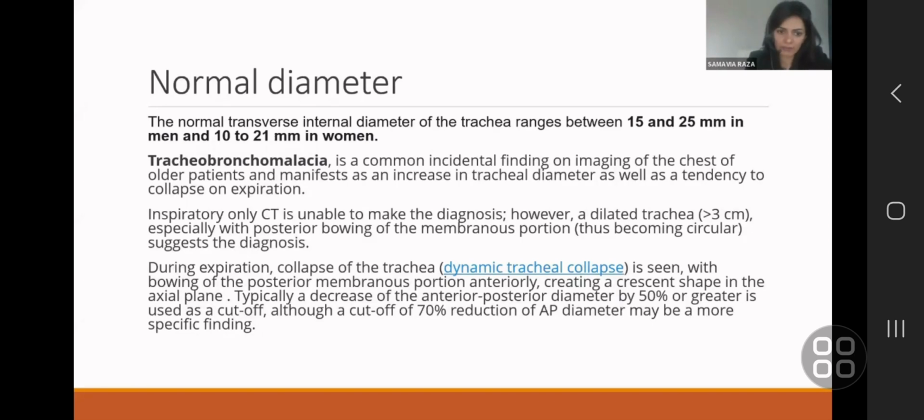Somebody having a tracheal stenosis will have it at birth. They will be born with it. It's a pediatric diagnosis. Somebody having tracheal stenosis in adulthood will have a cause of it. That cause cannot be missed. They would have been intubated or had trauma or had inhalation of a caustic agent or something like that. So if somebody has had a normal life, has had no specific local trauma to the trachea, iatrogenic or otherwise, and the query is tracheal stenosis, you can go ahead and reject that CT report.